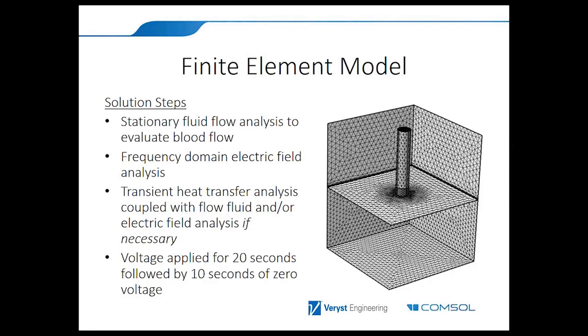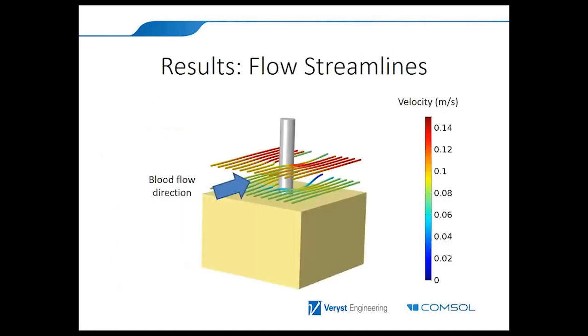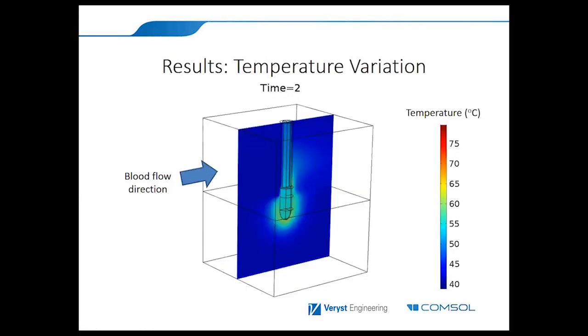Just for demonstration, we applied a voltage for 20 seconds, followed by no power for 10 seconds, and the properties are not exactly the right ones, but just to give you an idea of what you can do with COMSOL for RF ablation problems. So a little bit on the results, and then I'm going to go to the live demo. So this is how the blood flows. The streamlines come in from this side. You see they go around the electrode. No surprises there. This is an animation showing the temperature variation with time.